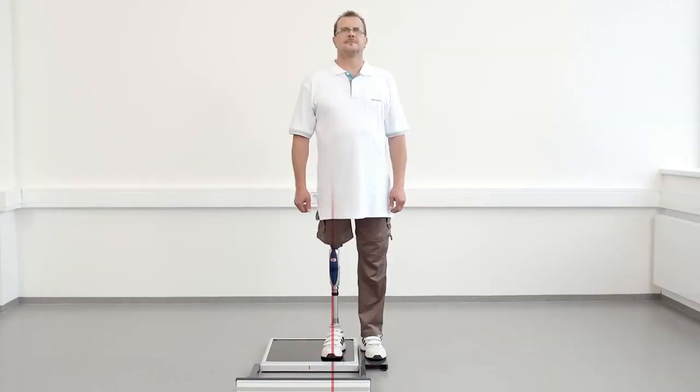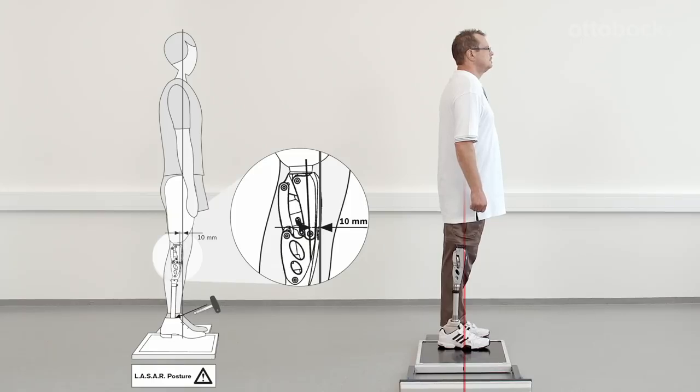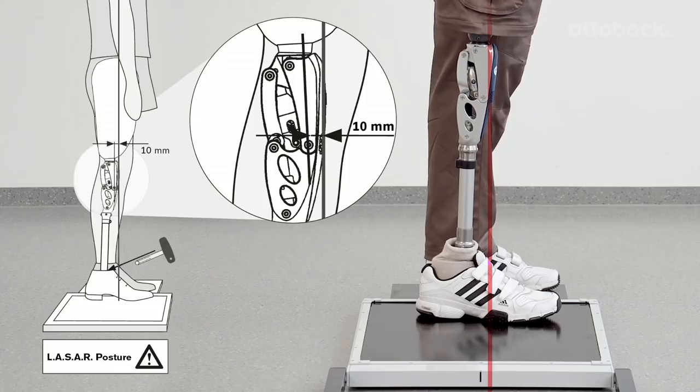In the frontal plane, the load line runs through the middle of the prosthetic foot, the middle to outer edge of the knee, and the middle of the socket. The sagittal plane alignment should now be adjusted solely by changing plantar flexion, so that the load line runs about 10 millimeters in front of the anterior lower knee axis.